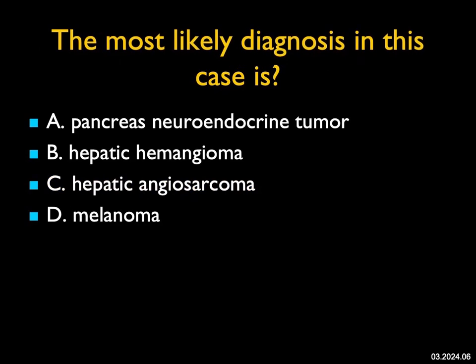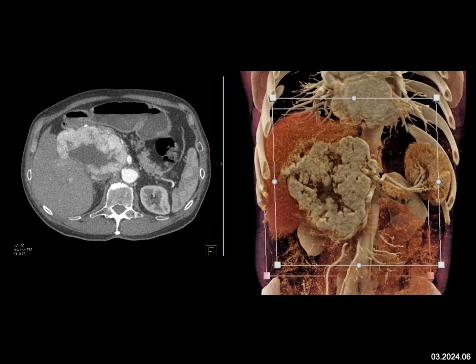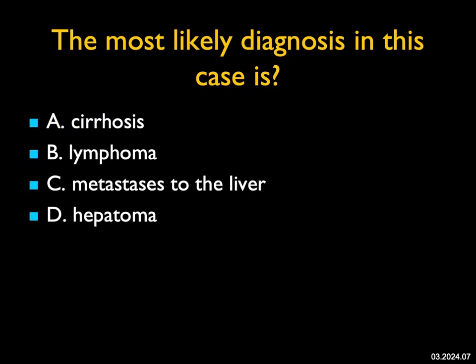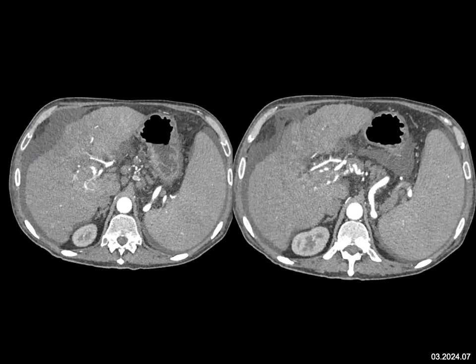The most likely diagnosis in this case: I see a very vascular mass in the region of the head of the pancreas, nicely seen on cinematic rendering as well. Is this a hepatic hemangioma? When you look at it, large pancreatic masses can sometimes simulate hepatic masses, but this really isn't the appearance of a hemangioma. If this were a liver mass I'd think about hepatoma or angiosarcoma. Melanoma mets can be vascular but typically not this vascular. This is a head-of-pancreas mass — a very vascular neuroendocrine tumor with central necrosis.